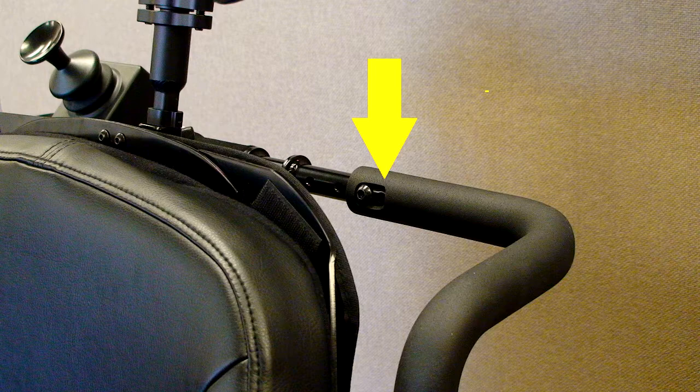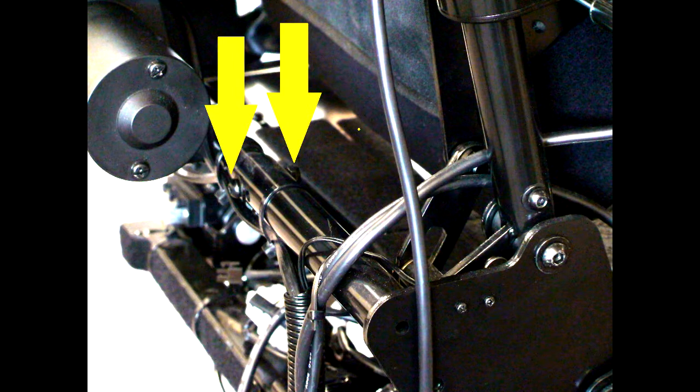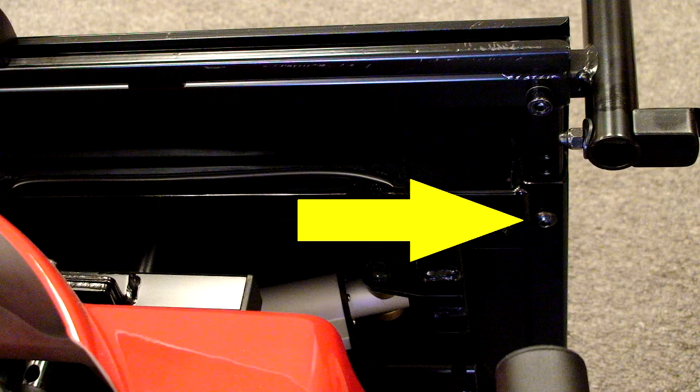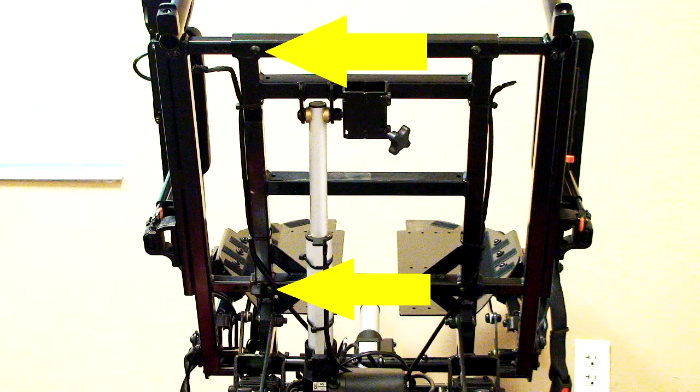Please note at this point we will only be doing one side at a time to maintain stability and make it easier to adjust. Now we're going to remove the two 4-millimeter allen screws which were under the foam from the right side of the handle — one screw in the front and one in the back. Next we're going to remove the 4-millimeter allen screw and washers from the lower seat back on the right side. Now we're going to remove the two 5-millimeter allen screws from under the seat on the right side, one in the front and one in the back. This is the shot from under the frame with the seat pan removed to give you a better idea of where the bolts are.